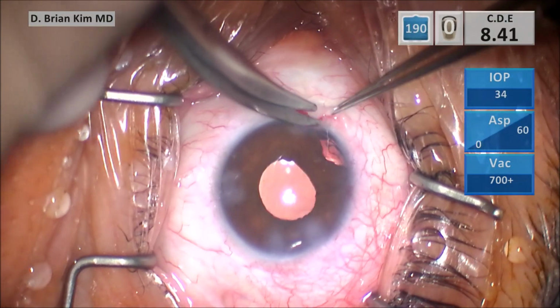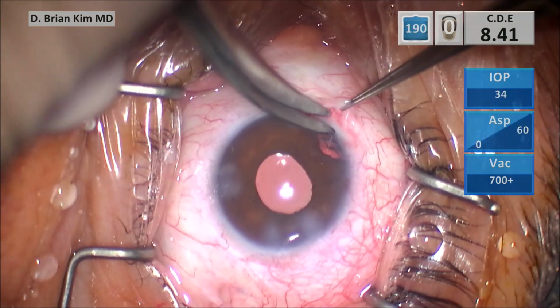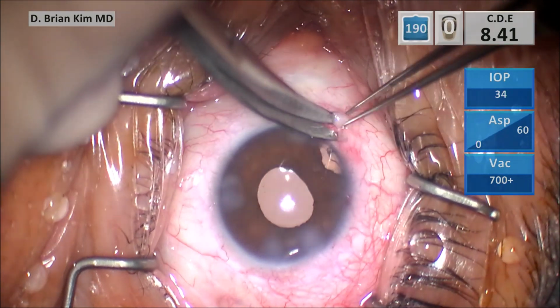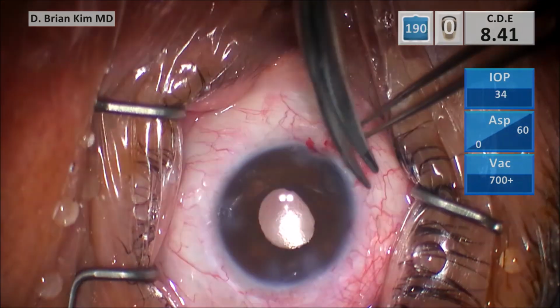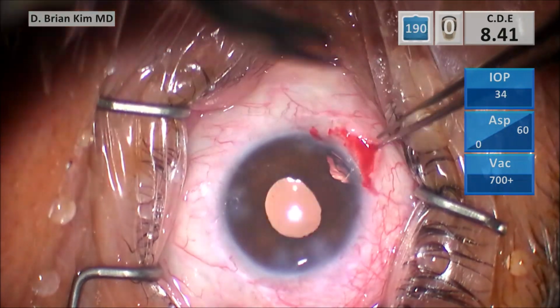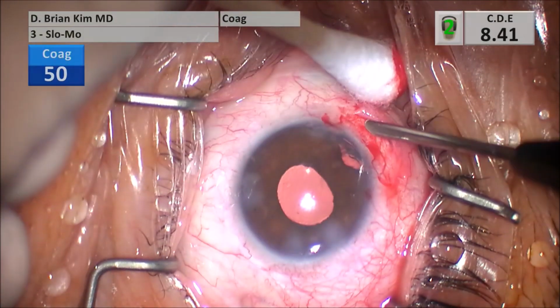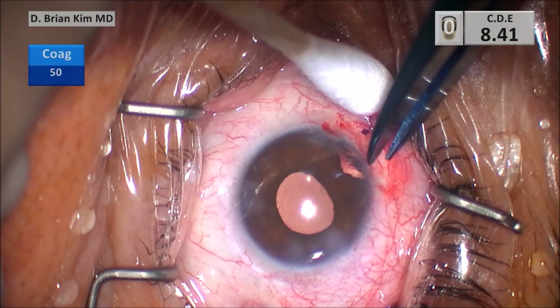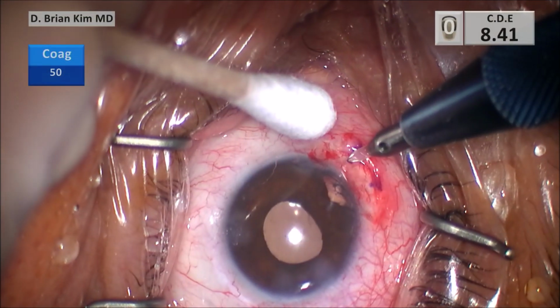Again, remember, I have this narrow wire speculum. I have better exposure of the sclera and the conjunctiva in this area. And so using this asymmetric speculum that Epsilon developed for me, I'm able to get better superior scleral and conjunctival exposure. I'm able to perform a peritomy in the area of the iridodialysis, do a little bit of cautery as well. And then I'm going to mark 1.5 millimeters posterior to the limbus at about 2 clock hours from there to there in the area of the dialysis.